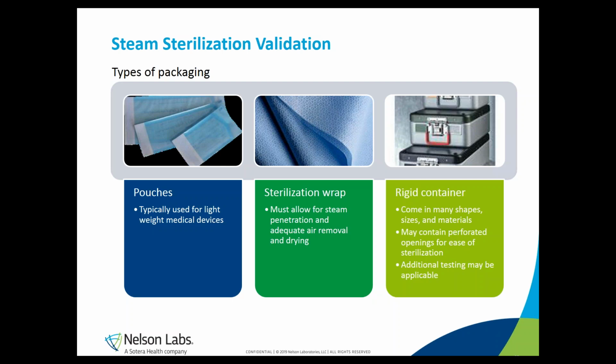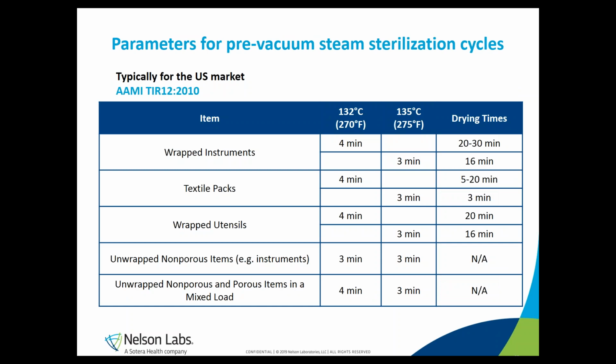Melissa, can you please also elaborate a little bit about the differences between the US market and the EU market as it comes to steam sterilization cycles? Yes, of course, Stephanie. So once the product is packaged, the actual sterilization process can begin. But there is indeed a difference between the EU market and the US market.